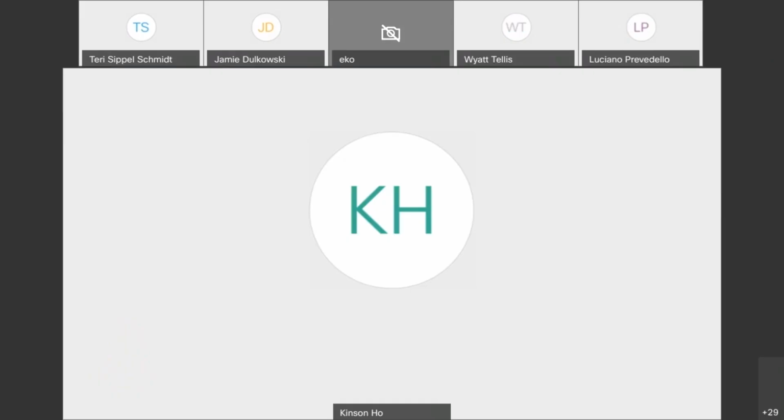So every vendor that implements any of the IHE profiles, radiology or other IHE domains, will publish something called an integration statement. It's usually a one-page, two-page, very simple document that lists all the profiles that they support, which actor in those profiles they support, as well as any options that the actor supports. So that gives you a good overview of what the capabilities of that system are, and then when you read the profile for the requirements of that particular actor, you get a sense of the supported capabilities of that particular system.